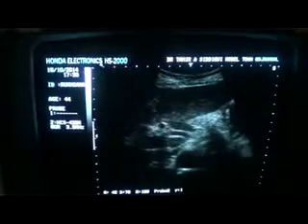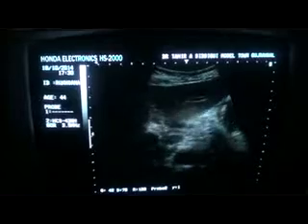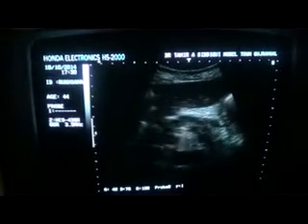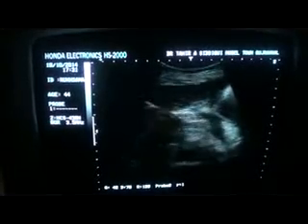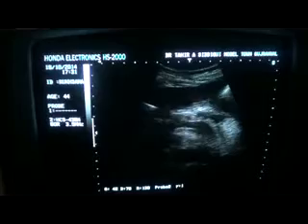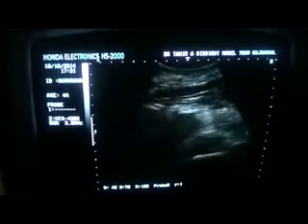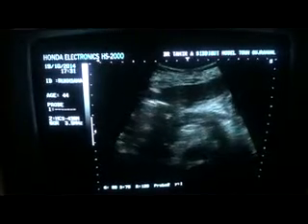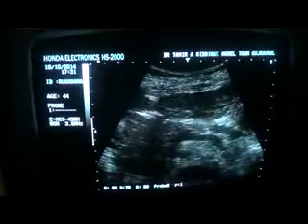This female patient, age 44, was operated upon for some mass relating to the pancreas 9 months back. No histopathological findings are provided, and we have to evaluate the pancreas.